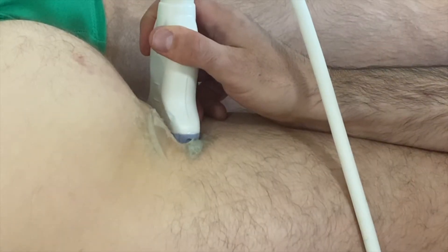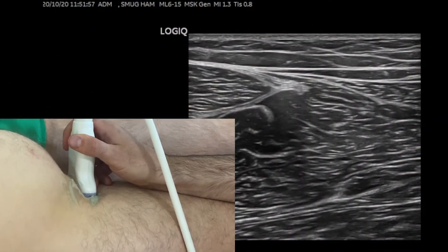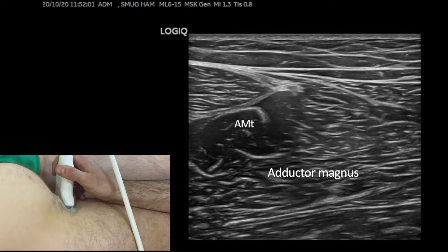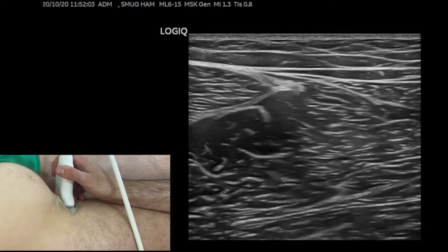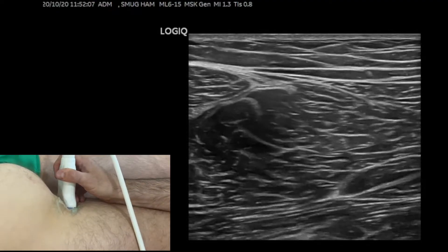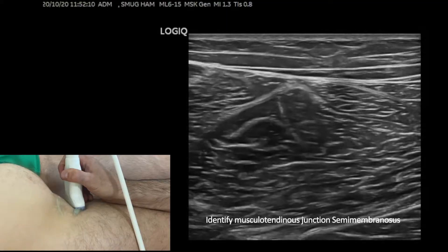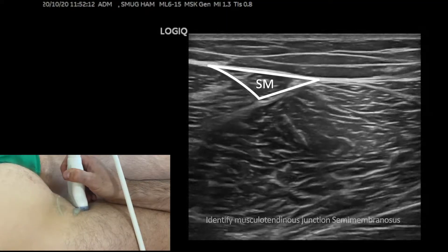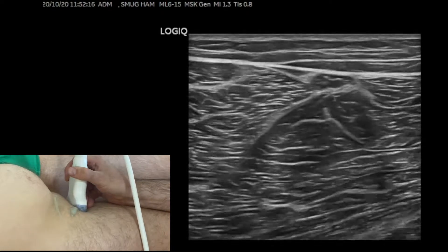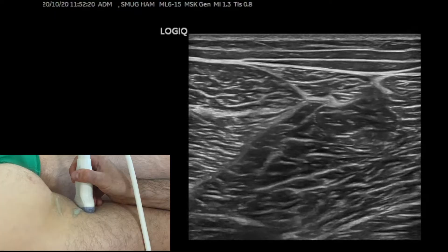We're going to talk through the proximal hamstring and we start on the medial side identifying the fascial plane. All this is adductor magnus with a small tendon of the adductor magnus there. So we're going to first identify the musculotendinous junction of the semimembranosus, which is a triangle that starts in this area here and gets bigger as we go distally. Going back proximally and then big distally, you see the semimembranosus muscle coming up.